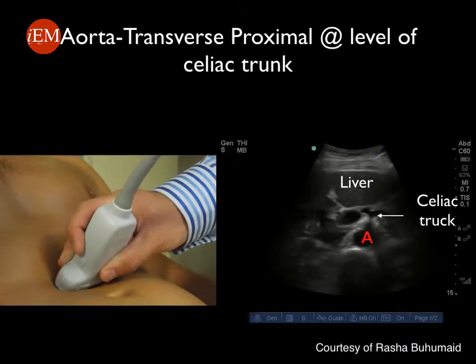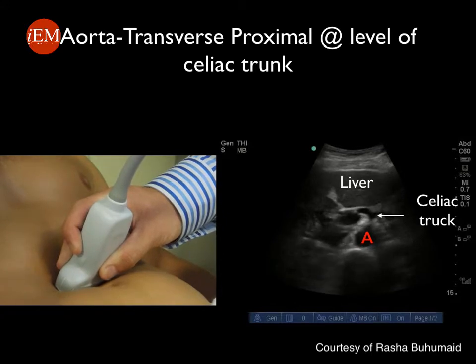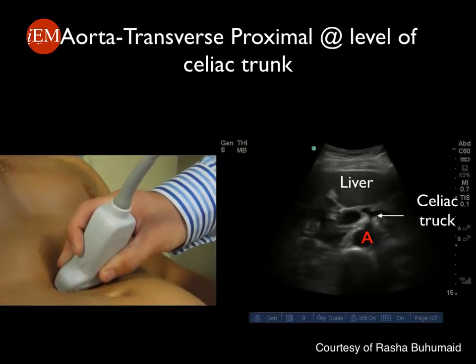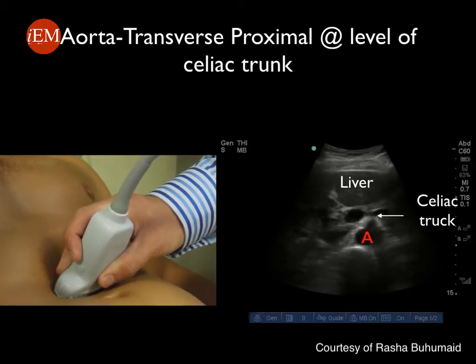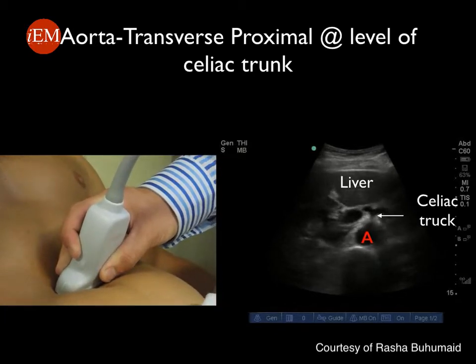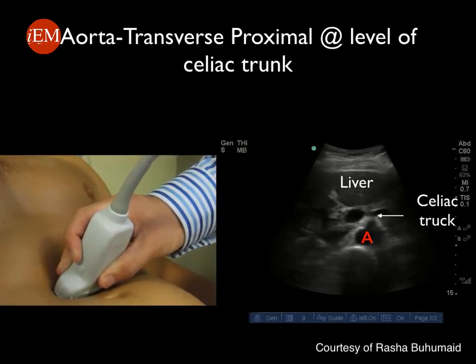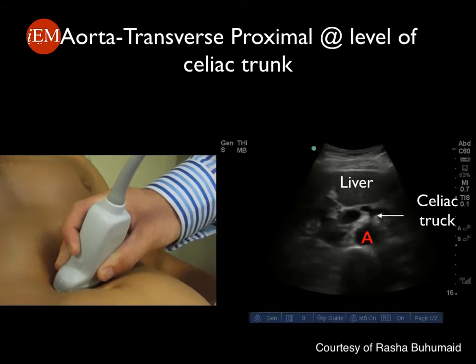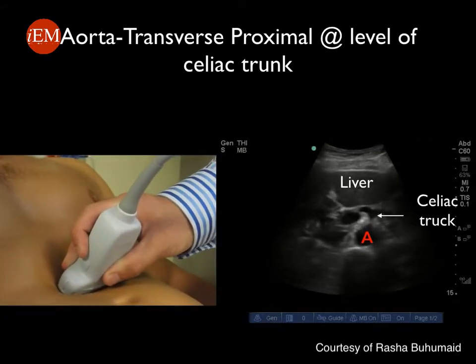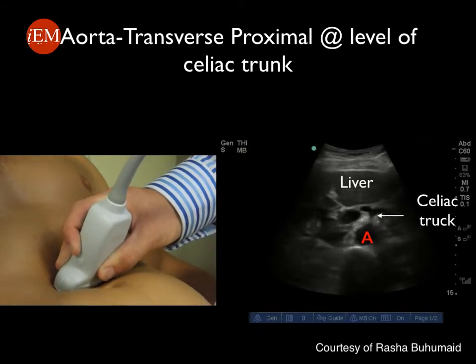You will start scanning proximally just below the xiphoid process. At this level you will see the corresponding ultrasound image showing the abdominal aorta as a circular structure just above the vertebral body, and you can actually identify the celiac trunk, which is the first branch of the abdominal aorta.